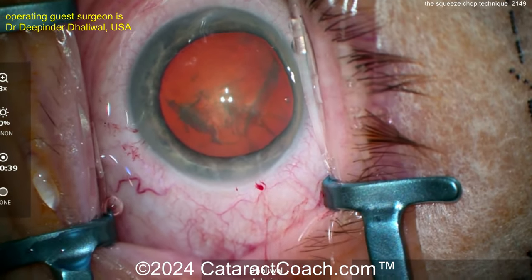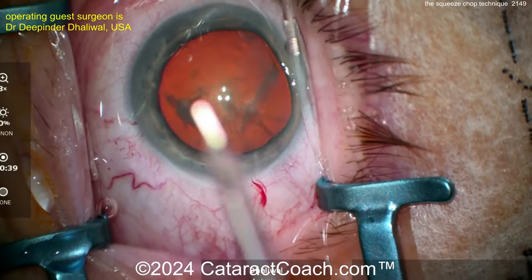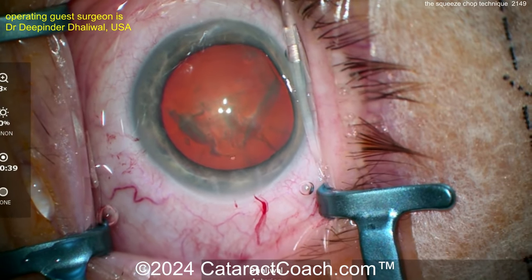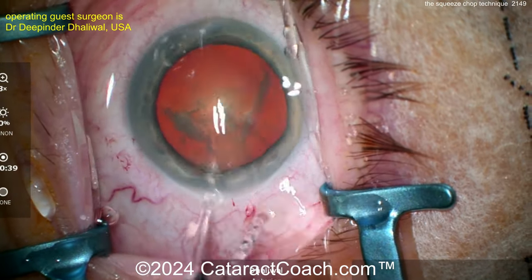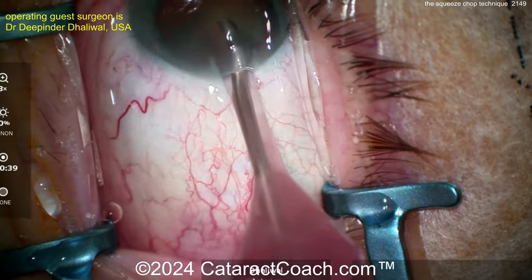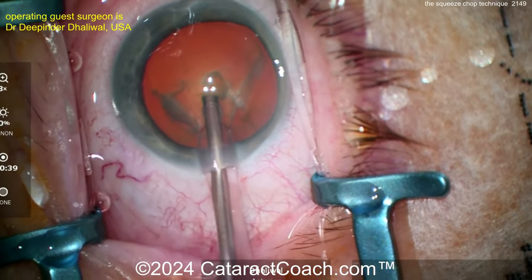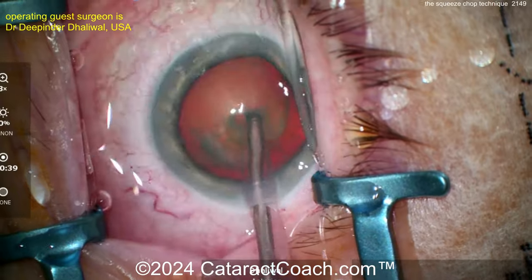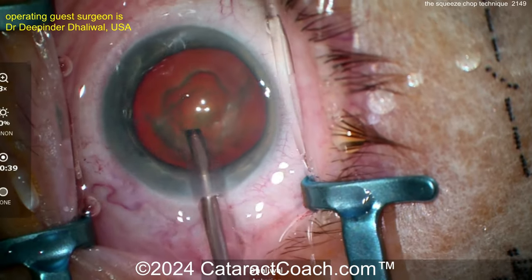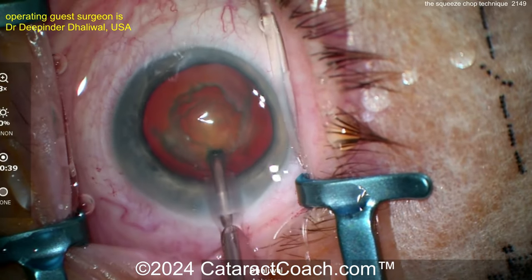Getting back to this case: hydrodissection has been done, the capsulorhexis is done. The technique is a stop-and-chop, but the chopping part does not require vacuum holding power — and that's a big advantage. Traditionally with any kind of chopping, we use the phaco probe and vacuum to hold the nucleus, but you have a finite window of maybe one or two seconds. Dr. Dhaliwal's approach is to simply squeeze the nuclear half between the chopper and the phaco tip, so there's no time constraint.